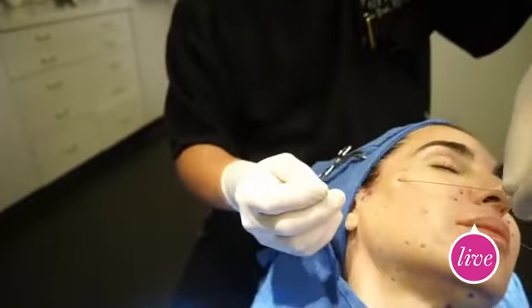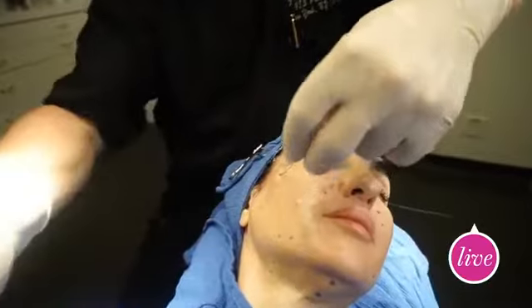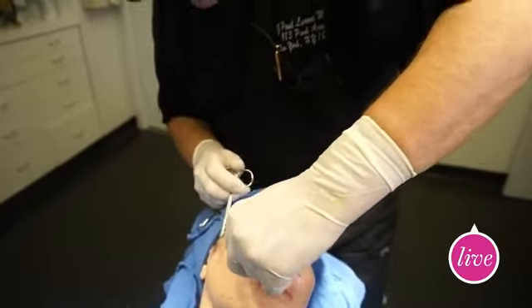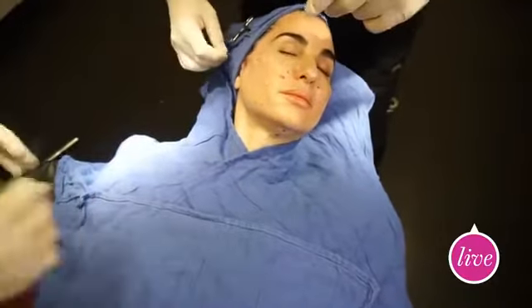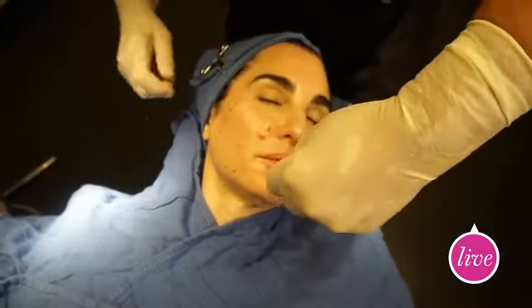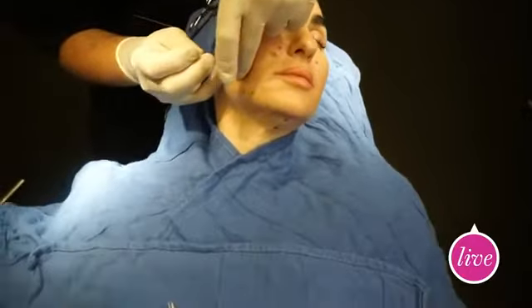And are there any adverse effects or downtime? I know a lot of patients get nervous that with a facelift, the downtime is extremely long. Is there any downtime with this? Well, maybe about 2 days. Patients can get a little bit of swelling, usually not very pronounced, but it can happen. So I typically tell patients that it's about 2 days of downtime. If you do it on a Friday, like we're doing it today, you'll be absolutely fine to resume full activity on Monday.